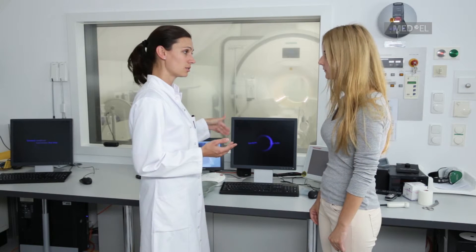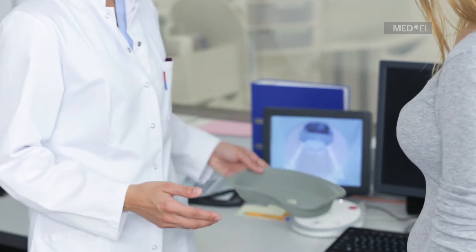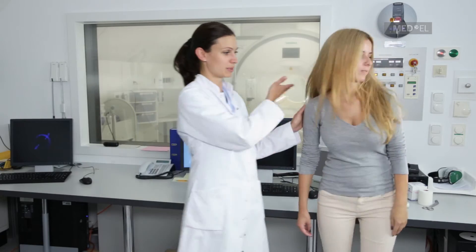Remove the external components of the implant system, such as the audio processor and any accessories, before the patient enters the scanner room. The patient may not be able to hear after removing their audio processor, but will be able to hear immediately after the processor is returned.